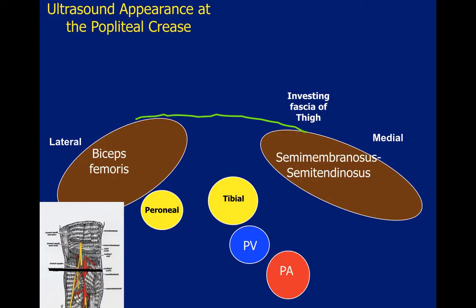Nerve blocks in the popliteal fossa below the division of the sciatic nerve are also popular. When blocking at the level of the tibial and peroneal nerves, onset is reportedly more rapid due to the smaller caliber of these individual branches in comparison to the larger caliber of the sciatic nerve. In addition, the imaging depth required to visualize the tibial and peroneal nerves is usually more shallow than that required for the sciatic nerve. As always, a direct approach to these nerves can be associated with painful paresthesia or injury.